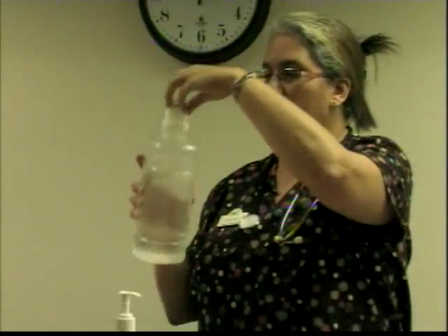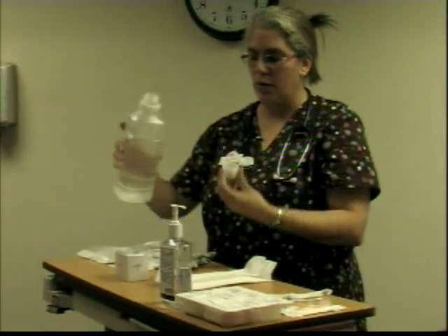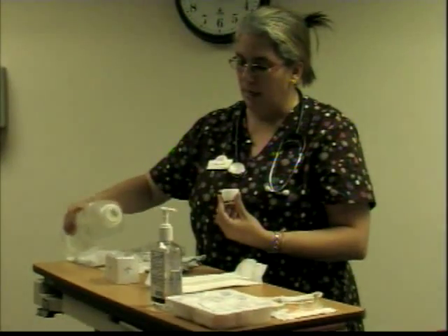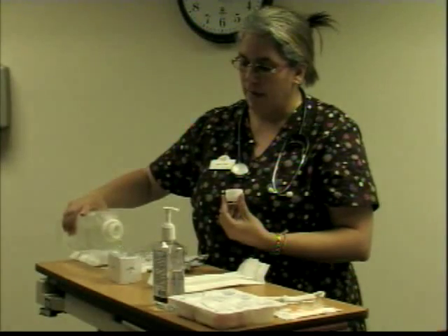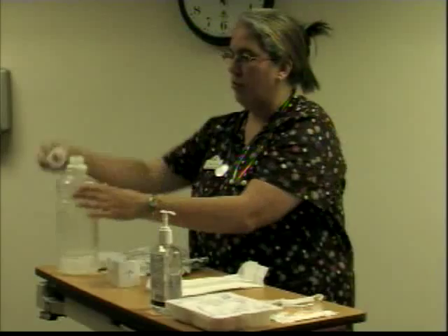And this is a new container that I'm opening, so I don't have to do that. All I have to do is make sure that this is up, and I am going to pour some of my saline, getting ready to go. Okay? And I am going to replace the cap.